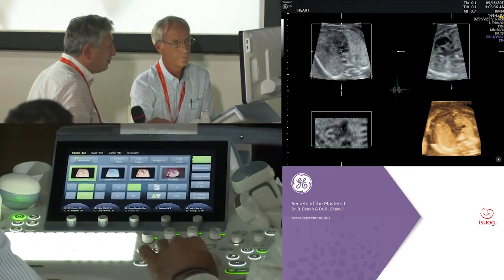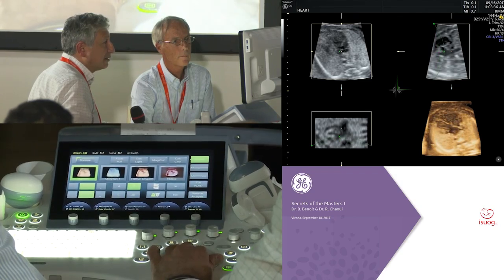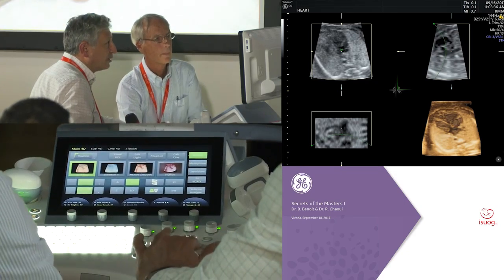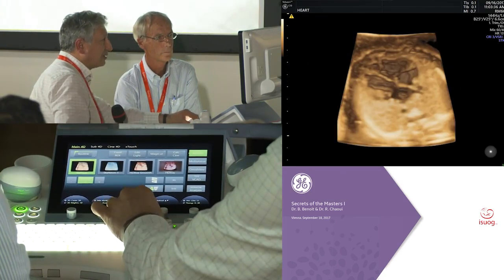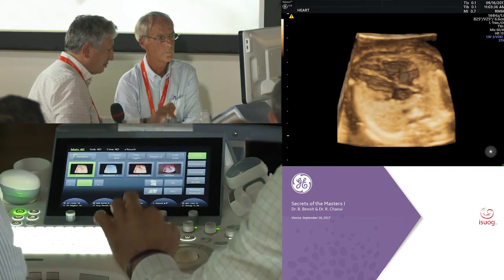Because I'm now in the B plane, I move it this way until I get under the aorta. Confirm. And then the lower part is like this. And then I check until I get a good view, so this is not bad, and then we activate.